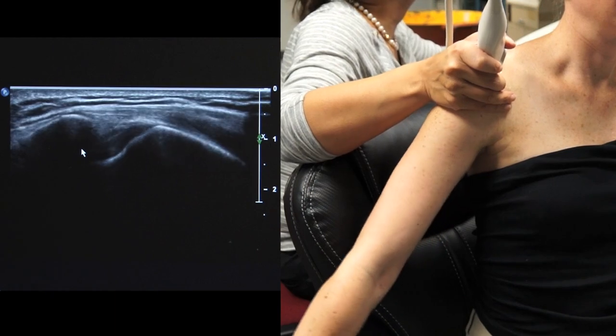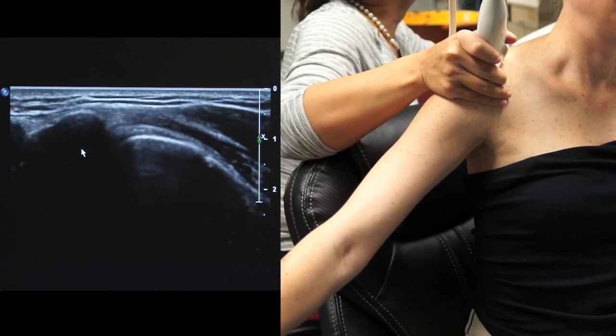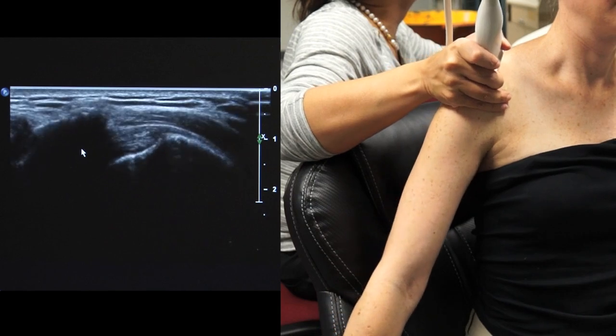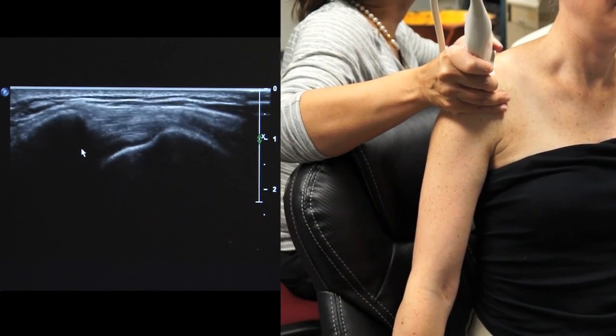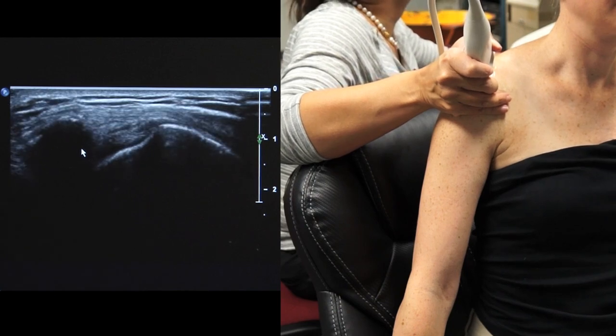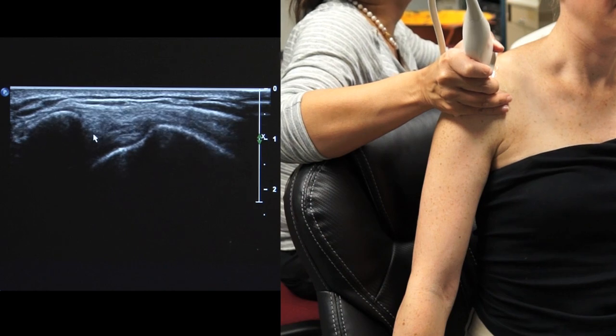You can go faster. Underneath the acromion. So here it is, the tendon completely under the acromion, which is normal, okay? And then you can see, keep going down, what happens when they lower their arm and you see more of the tendon. So with impingement, this will catch and not be able to slide completely under the acromion.